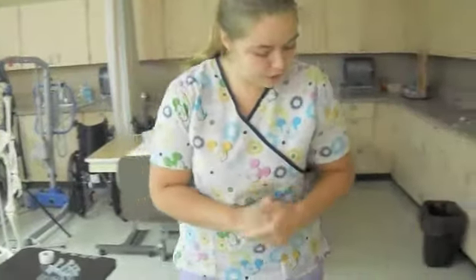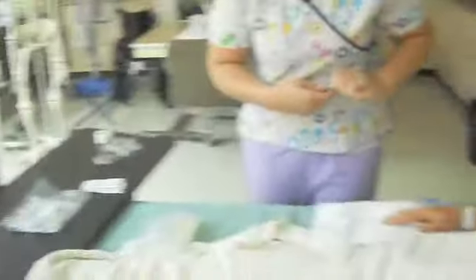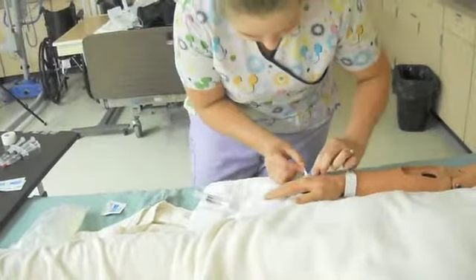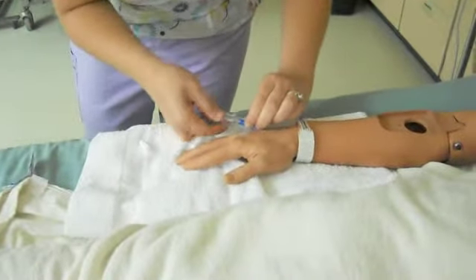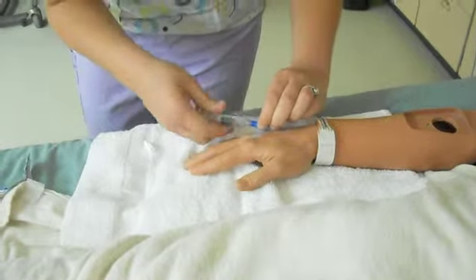This gentleman came up from the ER, so I don't know the patency of the IV. I want to check that by getting an alcohol prep — I don't need gloves because I'm just using alcohol. I'll scrub that for about 15 seconds, and then I'm just going to check the patency by flushing some in. Yep, it's patent.